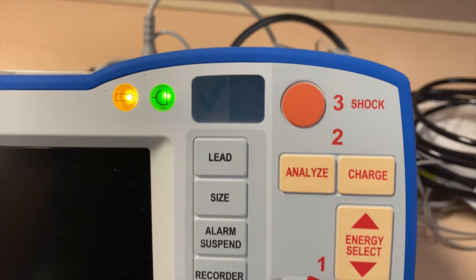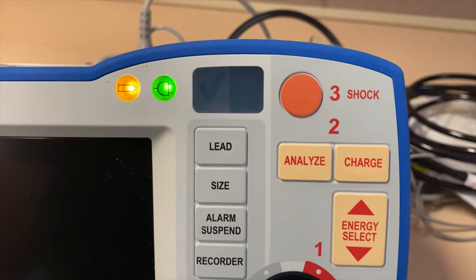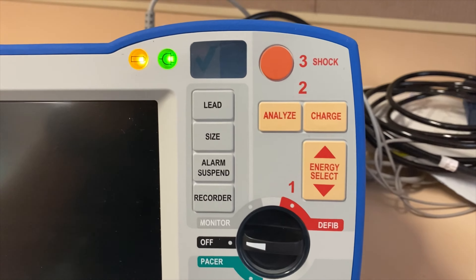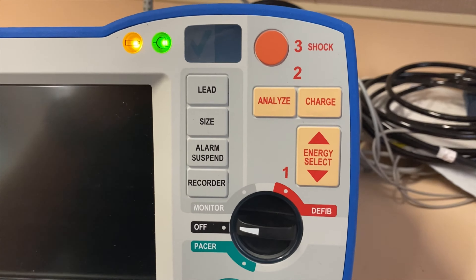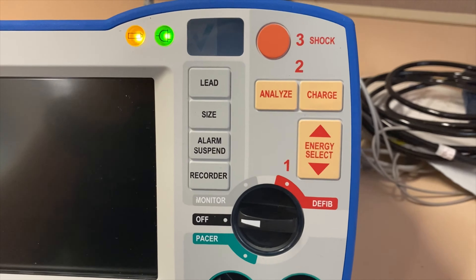In the screen, you would see a check mark. That signifies that it is ready for use. Check your institutional policy, but normally this will do a self-test at 4 a.m. in the morning and it will run a self-test on the pads itself. You just want to make sure that this is plugged in correctly into your pad.